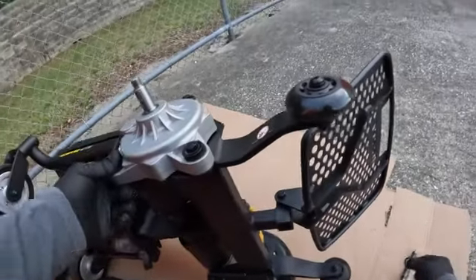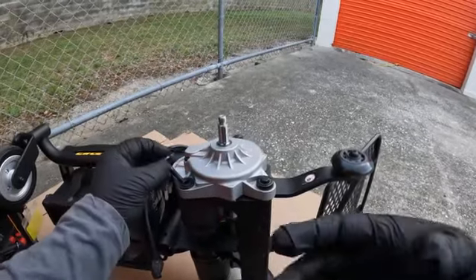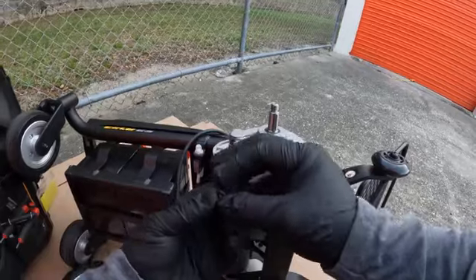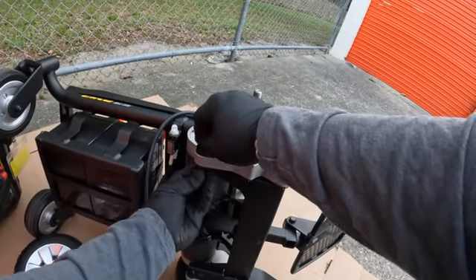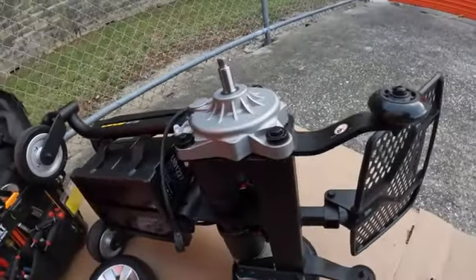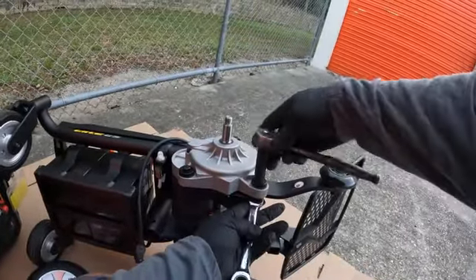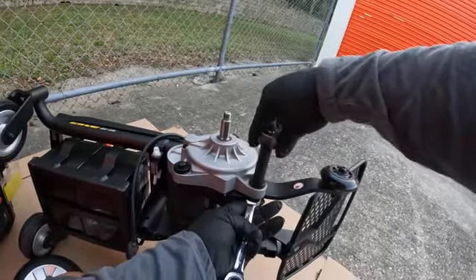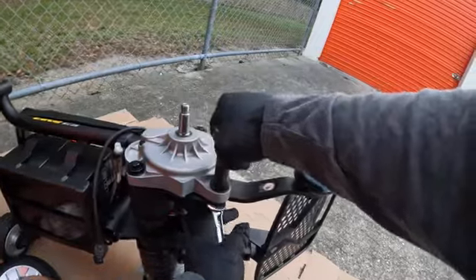And every time you install the motors, before you take anything off, make sure that you have the correct part, because a lot of times they might send you the wrong part and you take everything off. I've done it so many times, man. You take everything off and they send you the left motor instead of the right one, if you're only replacing one. Which typically, if it's a brand new unit and one motor's out, then yeah. But if you have a unit that's even, I would say, a year and a half, 2 years, then I would definitely replace both motors.